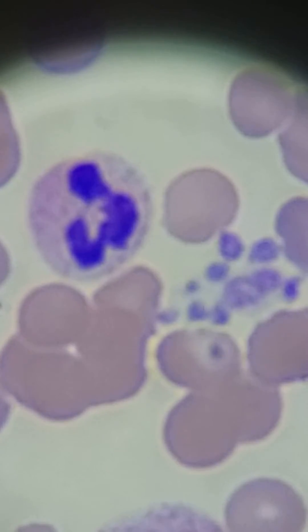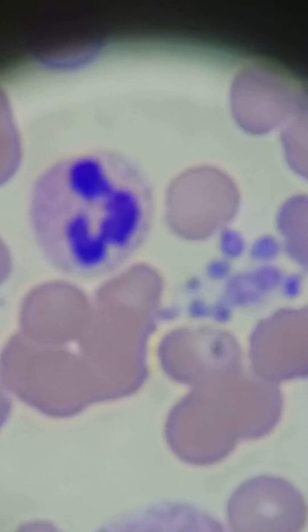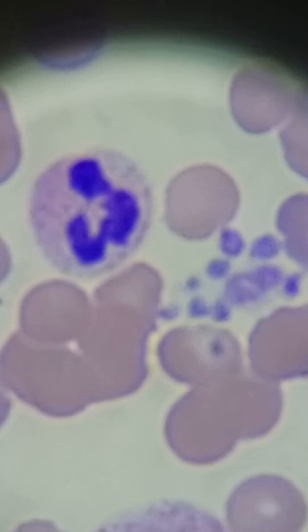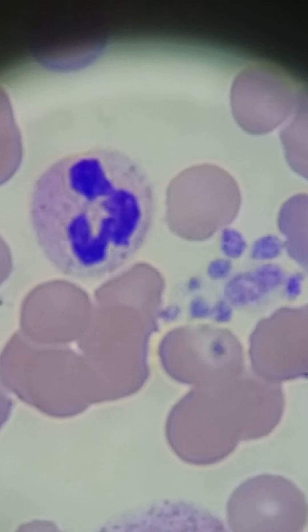I'm moving them down into the middle. You might get a flag on your analyzer if you have a platelet clump there. It might have a falsely low platelet count in regard to that. And that's actually what has happened on this instrument printout.